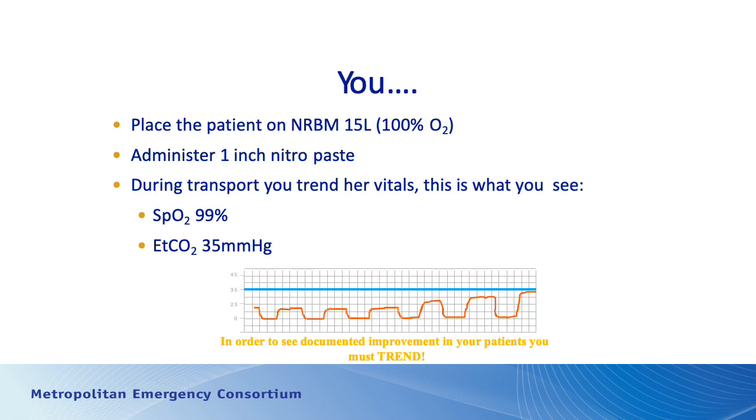So from my perspective, this patient most likely is in CHF and has pulmonary edema. Her vital signs showed hypoxia, so we'll start her on some supplemental oxygen. Our protocol calls for nitroglycerin, which we'll apply. And her CO2 level is low, which suggests that she is hyperventilating. Keep in mind that often our patients will have trouble with oxygenation before they develop trouble with CO2 retention. So in this patient, she was compensating for hypoxia by hyperventilating, or breathing faster. That results in carbon dioxide being blown off.